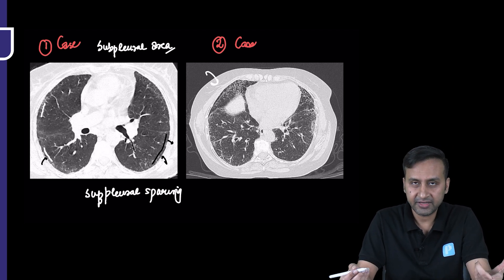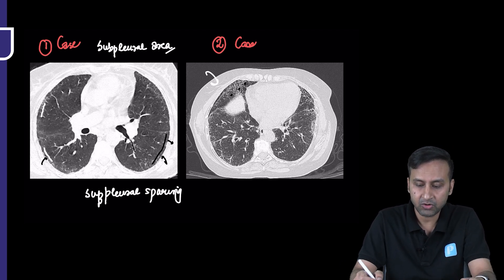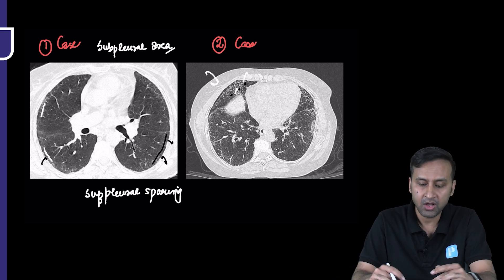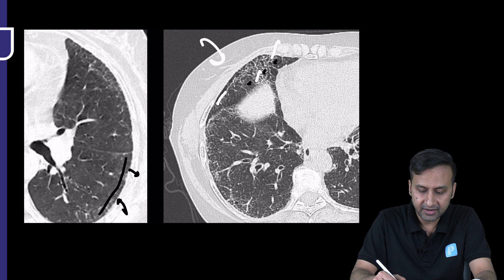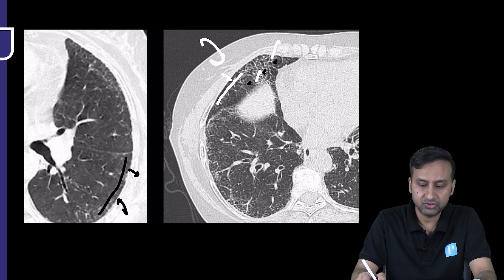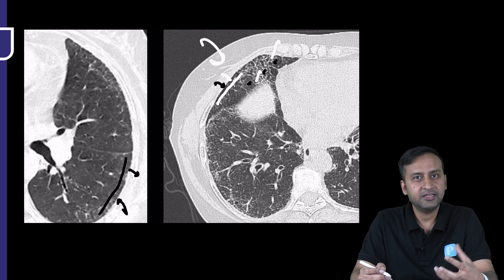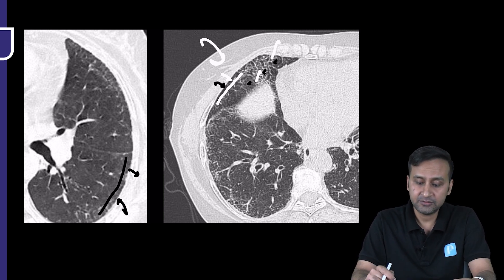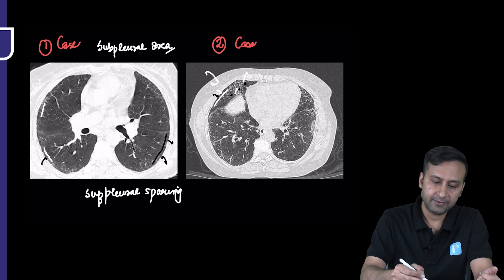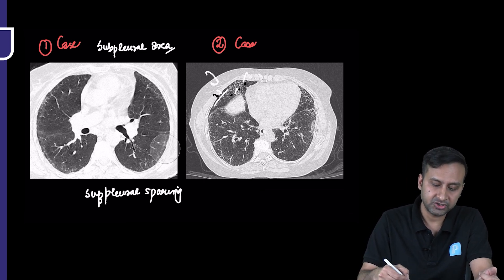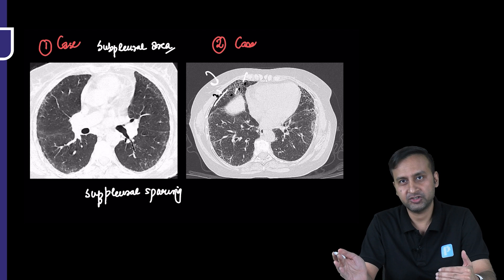The second case shows a more advanced, more fibrosing disease — we can see an extensive number of lines. But again in this case, a line can be drawn separating the diseased lung from the normal subjacent lung. The lung just underneath the pleura is completely spared of the disease process. This is what we call subpleural sparing — one important observation in addition to those already made.